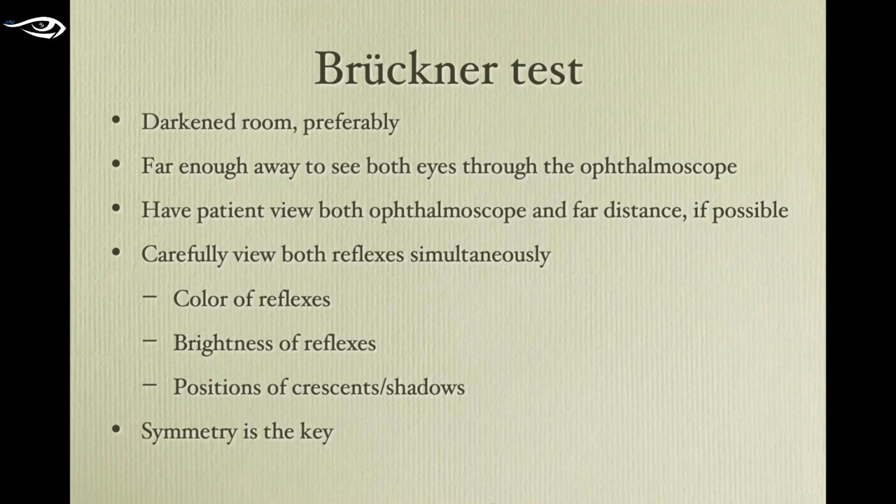I bring the patient in the room and I'm doing my observation and I'm taking my history. I will whip out my direct ophthalmoscope. I will darken the room a little bit, not a whole lot. I'll put about a +1 in the direct ophthalmoscope. I'll then look at the child through that. I'm lighting up both eyes. If I'm able to get the child to look at a far object by having a toy at the end of the room or a colleague at the end of the room making noise, I'll do that.